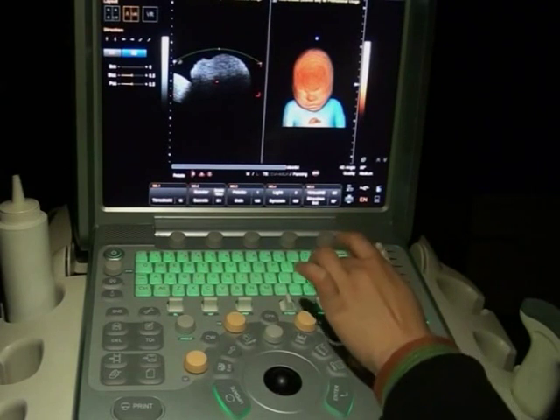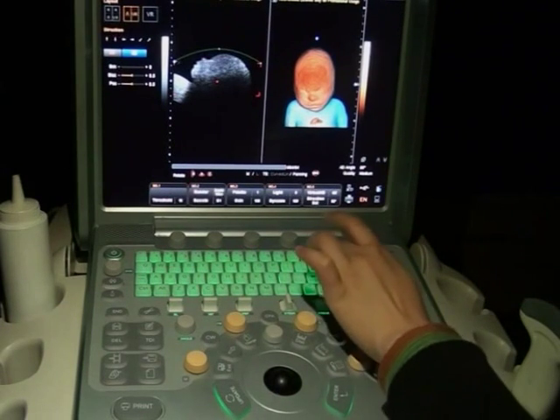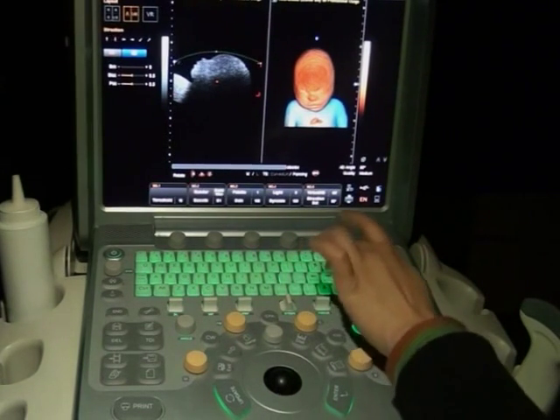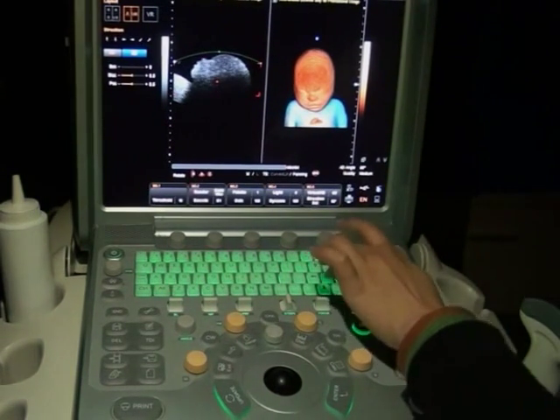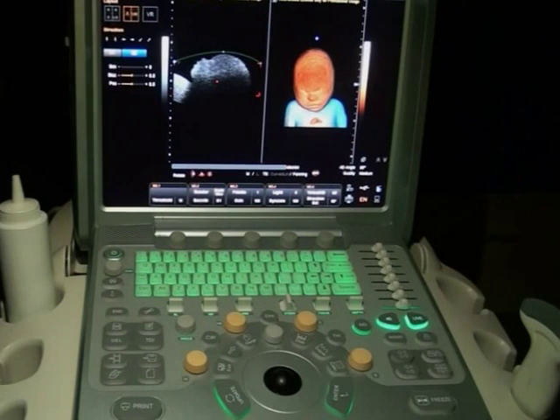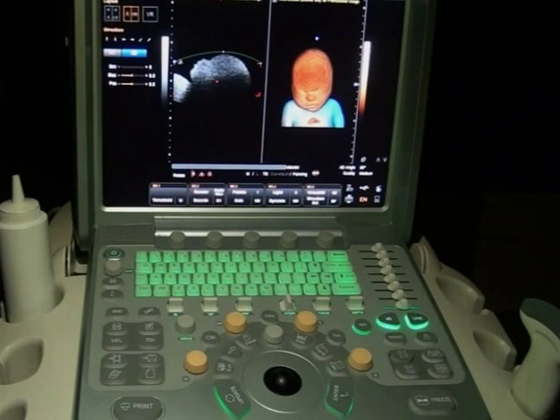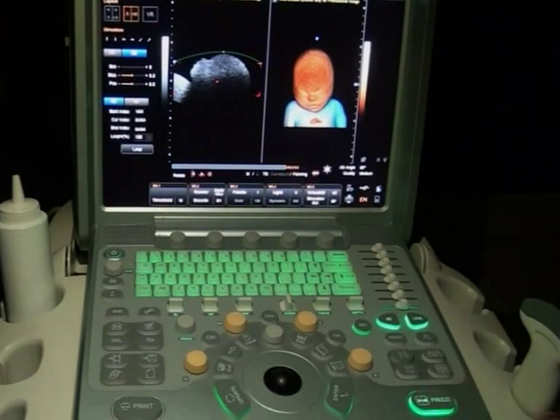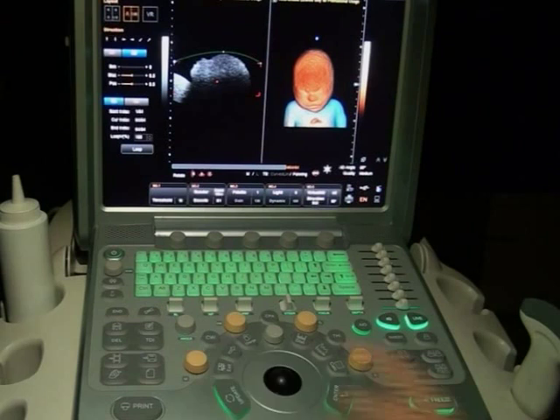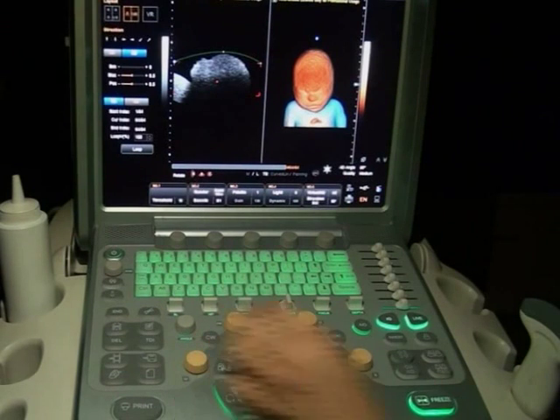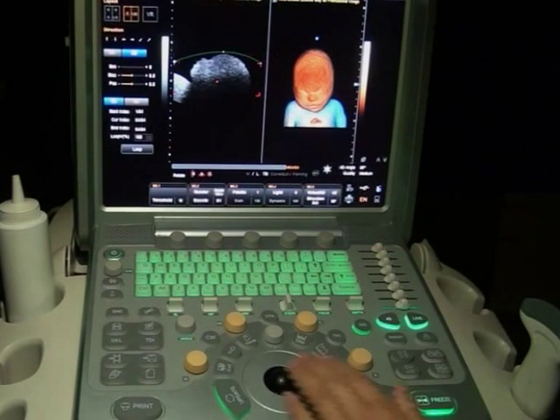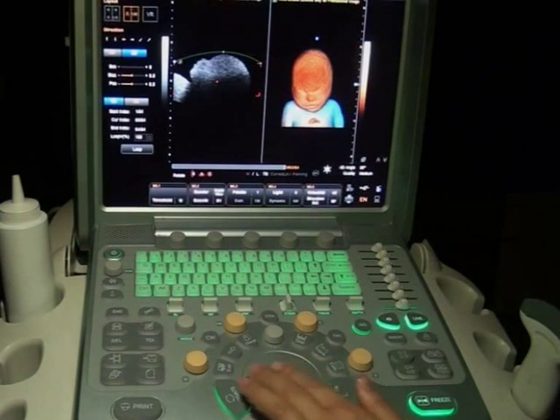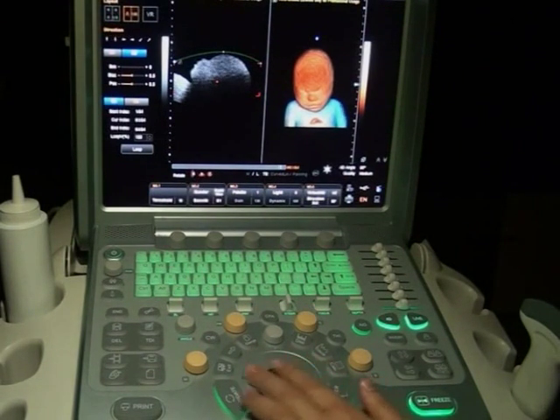Press the up, down, left, and right keys to change the radian of the curved line. Now freeze the image. Press the M knob to switch the trackball function, then move the trackball to play the signal loop in freeze mode.